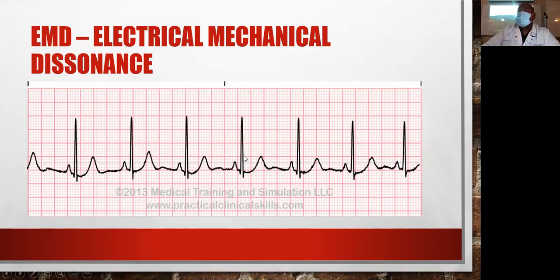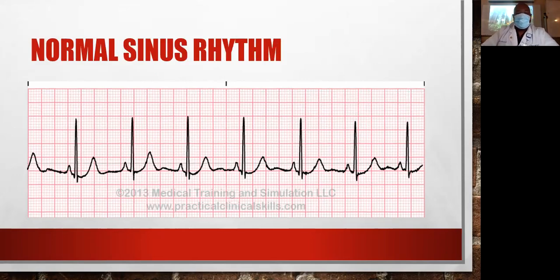Oh, his heart rate is fine. No, go check his pulse because it may be absent. And that's pulseless electrical activity. So the electricity is working, but the actual squeezing, depolarization, and repolarization is not happening. See, they use the same one for normal sinus rhythm. They look the same, but this one, he will have a pulse.